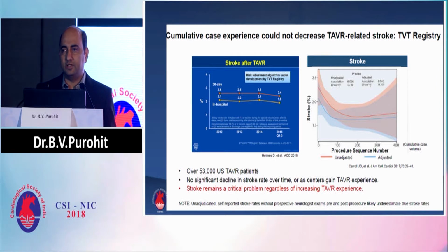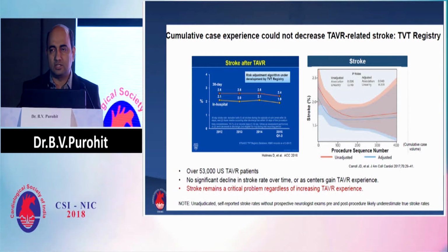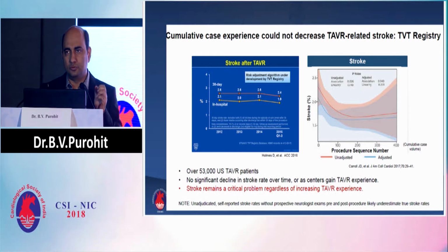So what are the options we have? Two things are very important. One is to maintain the anticoagulation properly, because the most important debris when they analyzed it was thrombus. If you maintain your anticoagulation properly during the procedure, you will probably be able to reduce some of it. People are suggesting that we should go ahead with using other anticoagulants, or only aspirin, and whether it is enough is debatable. But I will be concentrating more on the device which is used, that is the embolic protection device.